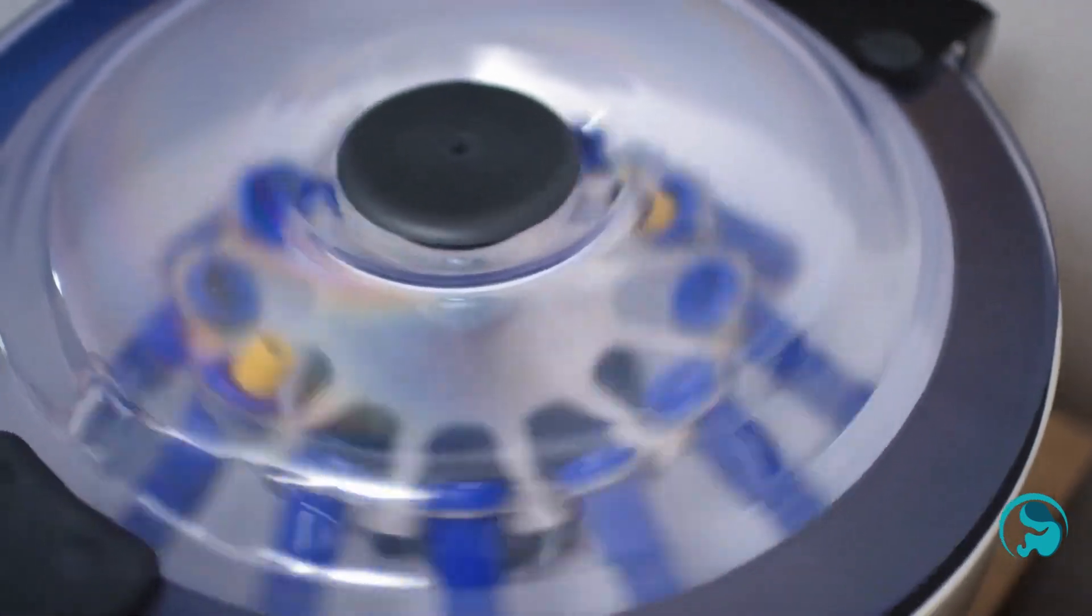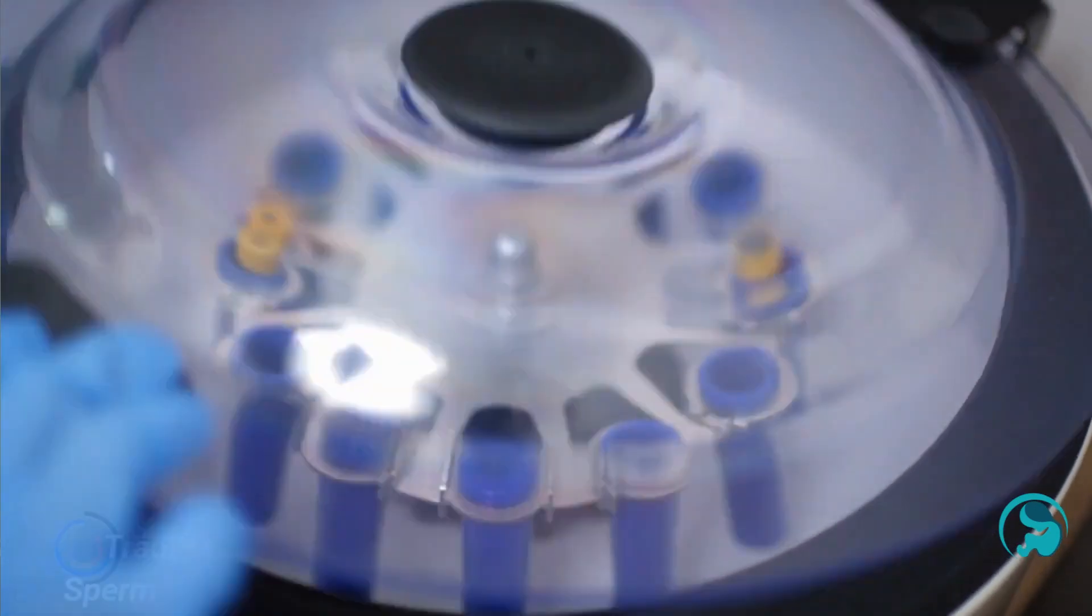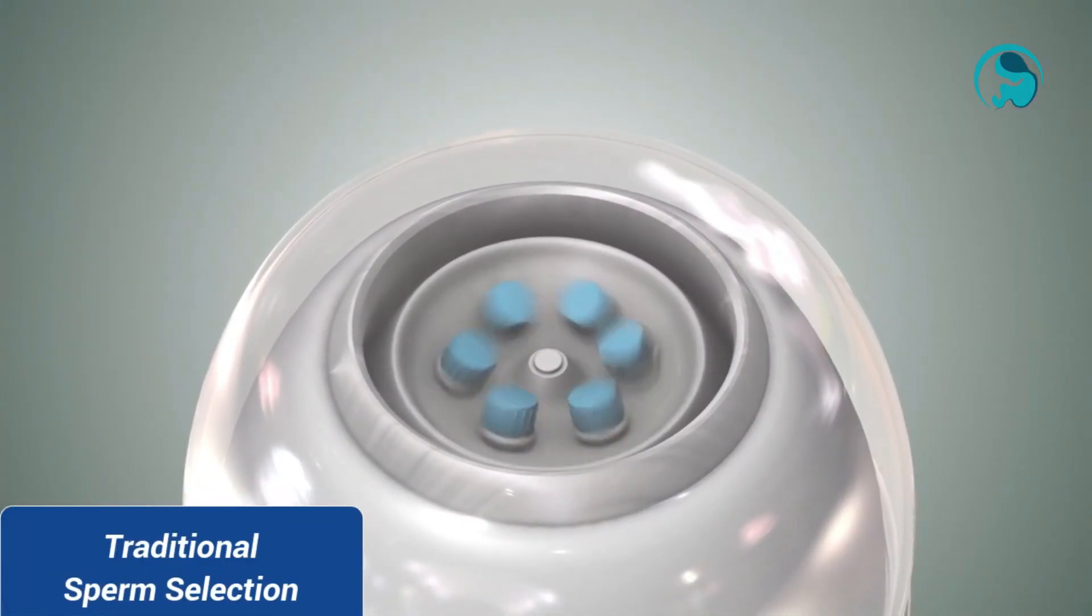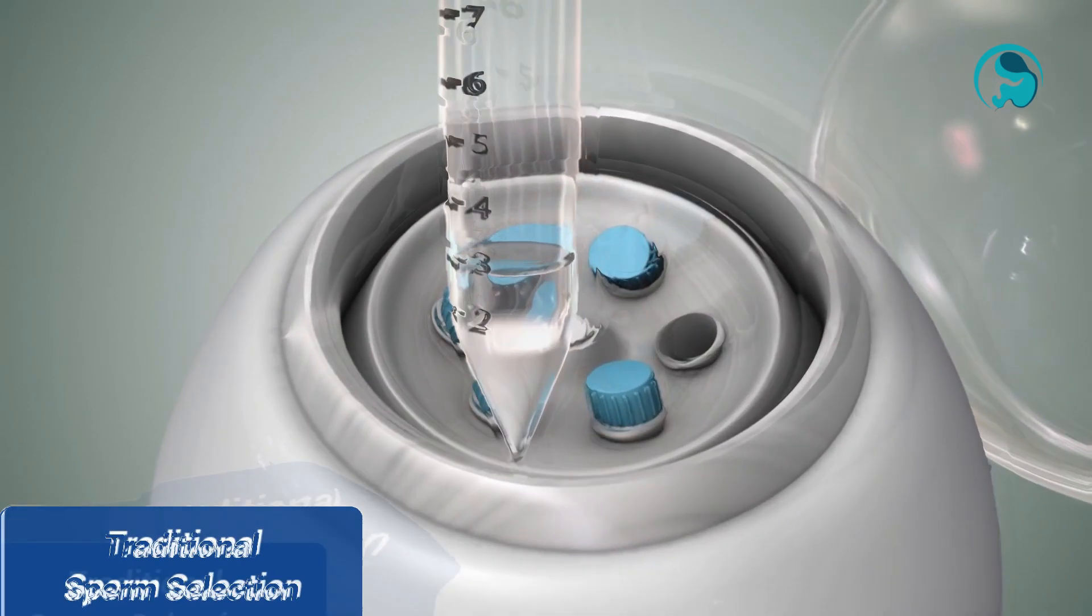One of the major disadvantages of this method is that spinning the semen sample at high speed can cause mechanical stress and damage to the DNA of the delicate sperm cells.